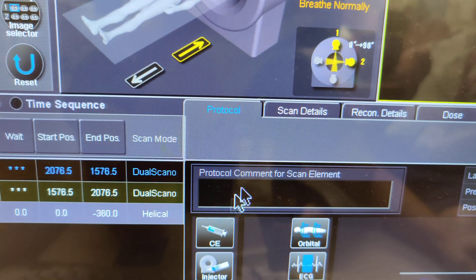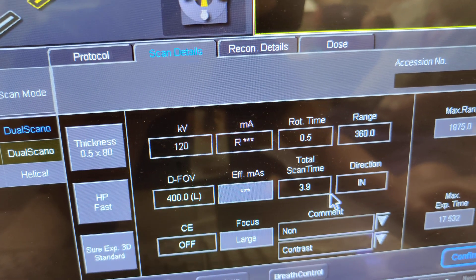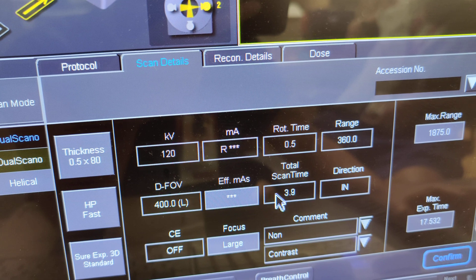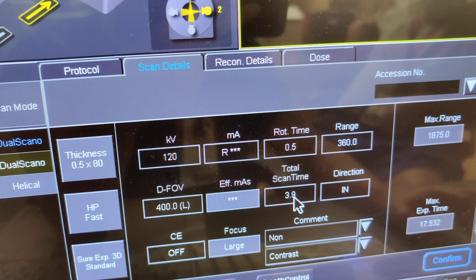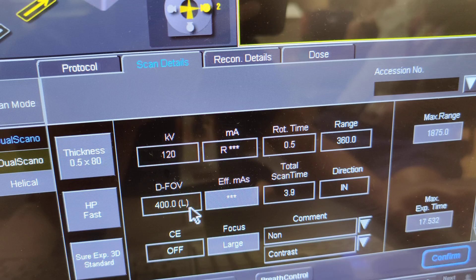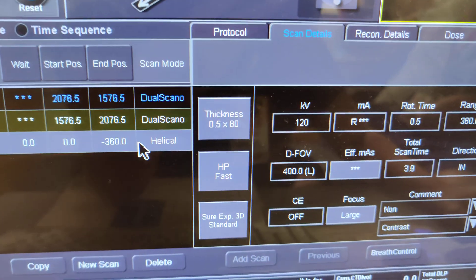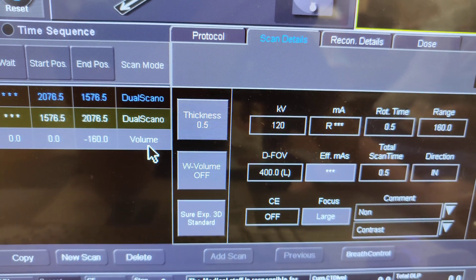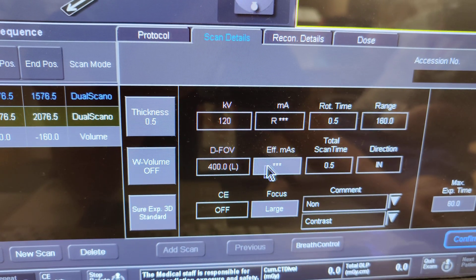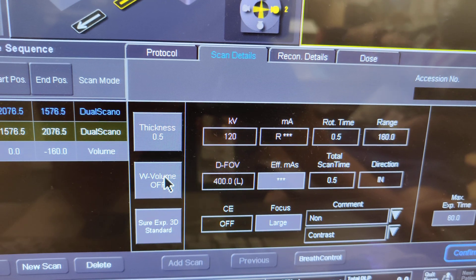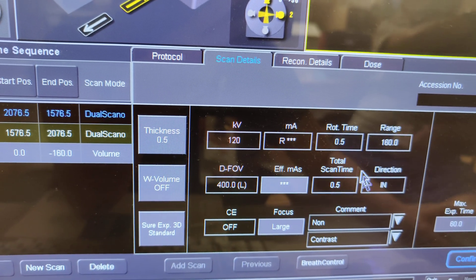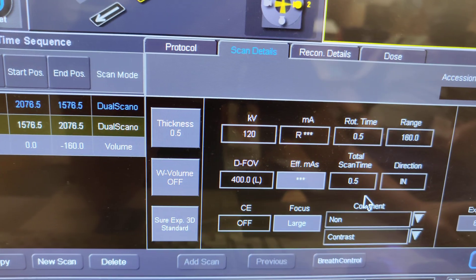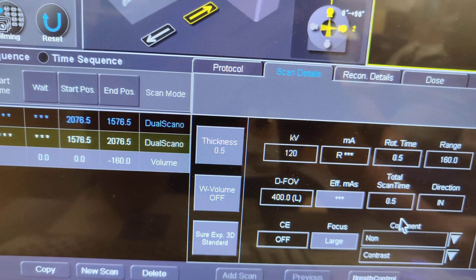Looking at the scan details, the total scan time would be 3.9 seconds for that field of view. If you change it to volume, you can see that volume is much faster for even that same amount of space, because it's one quick scan — and it depends on the detector and number of slices you have.